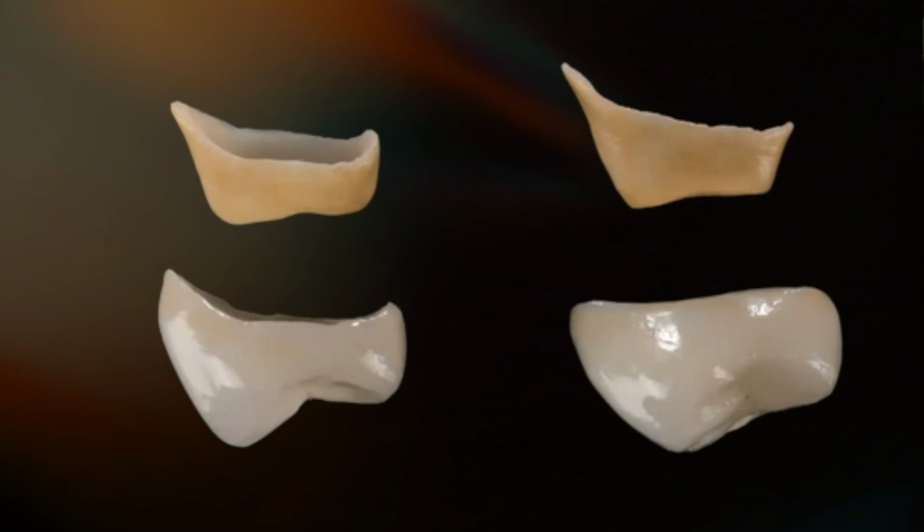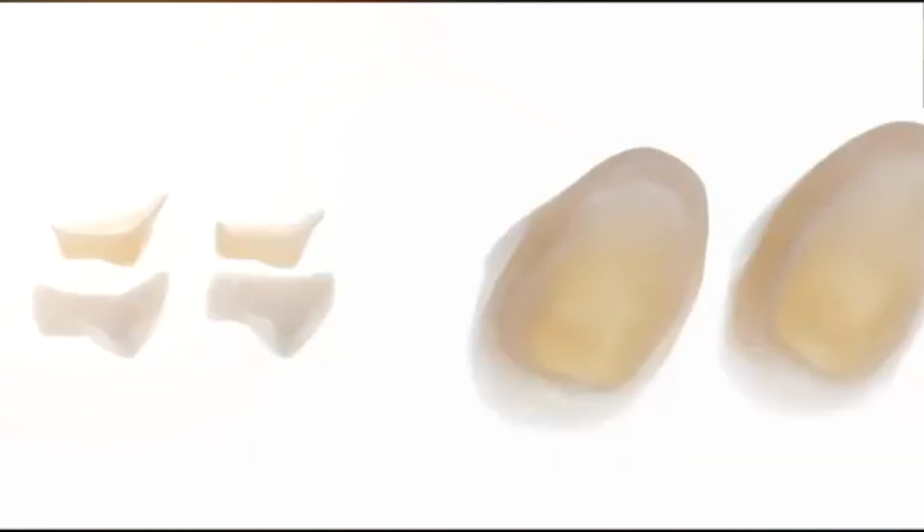If the space is thin, you need to make the coping first and then the technician makes like manually a thin chamfer there and rescans. I'm talking about if you want to get very good precision. Another disadvantage is you have two interfaces of cement, so it's also technically sensitive. But again, it is an option.